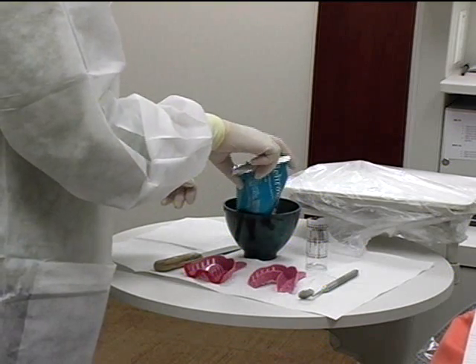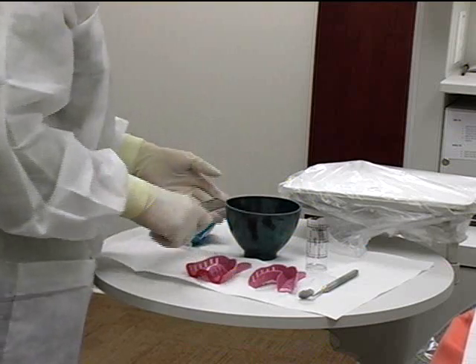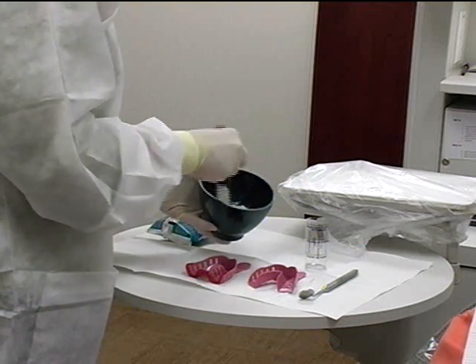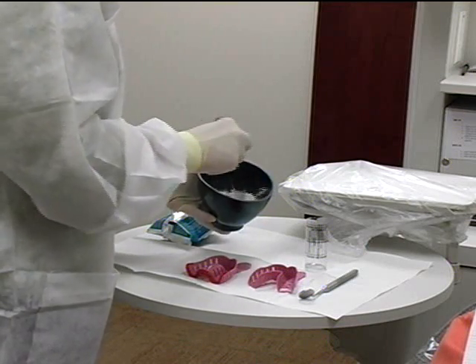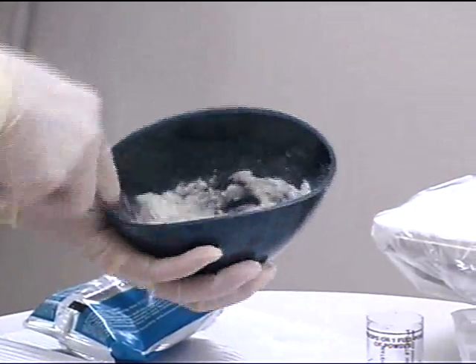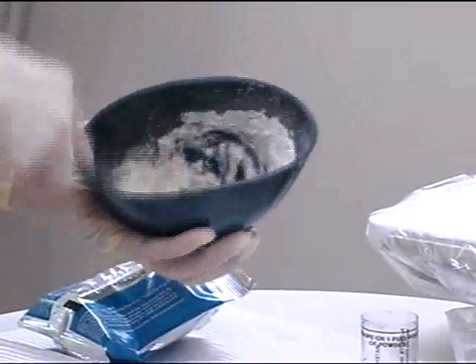Add and mix the powder slowly into the water. Then use the flat spatula blade to press the material to the side, while rotating the bowl to remove air bubbles. Continue mixing for 45 to 60 seconds.